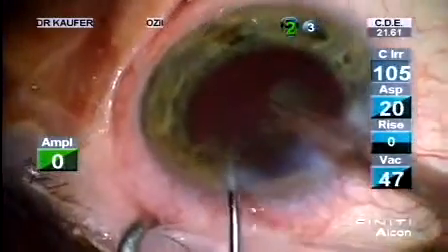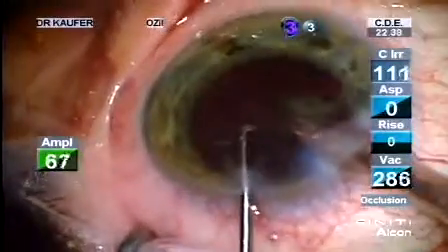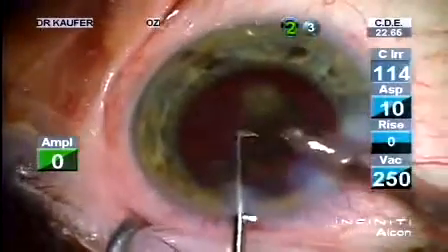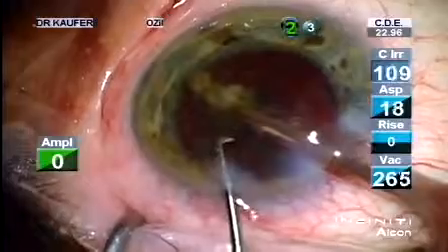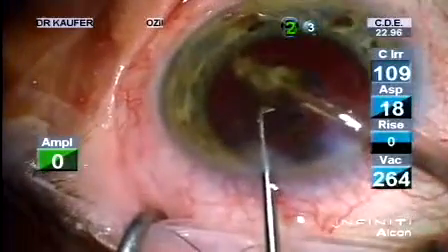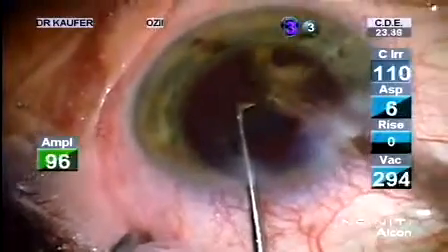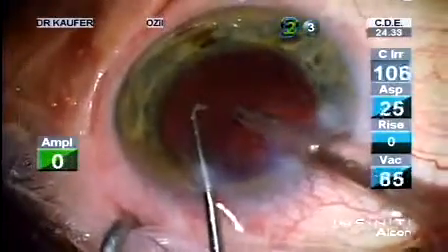As opposed to longitudinal ultrasound, with longitudinal ultrasound, what you would normally do in a case like this, for example, is you would look to embed, wait for the vacuum to go up, and then press position 3. That is something you do not want with Ozil. You want to put it there and go straight to position 3, and you see how it completely disassembles that nucleus.